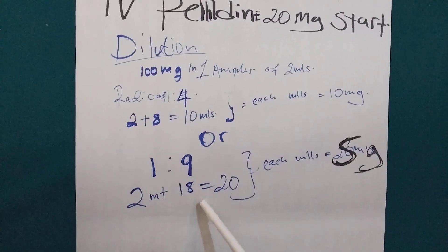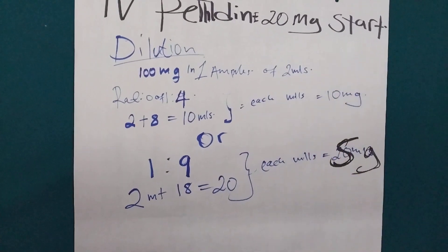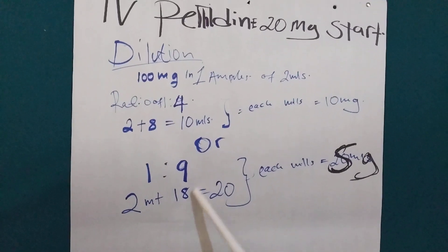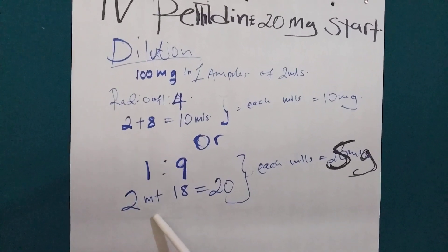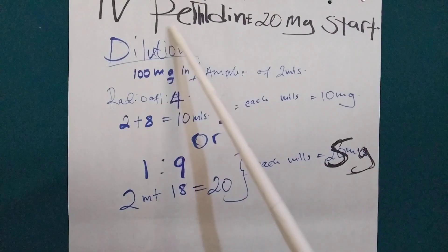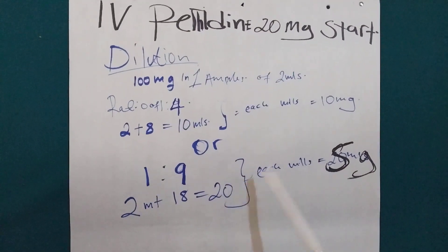So, we are going to use a 20 mL syringe in this case. We are going to aspirate 18 mL of normal saline or water for injection and then we are going to add 2 mL of Pethidine.